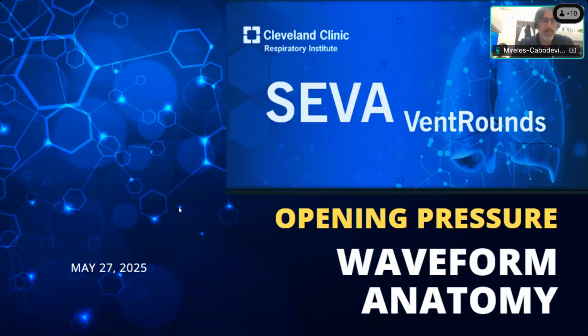Welcome to SEVA VentRounds. Today is May 27, 2025, and the topic for today is opening pressure, and we're going to talk a little bit about waveform anatomy.